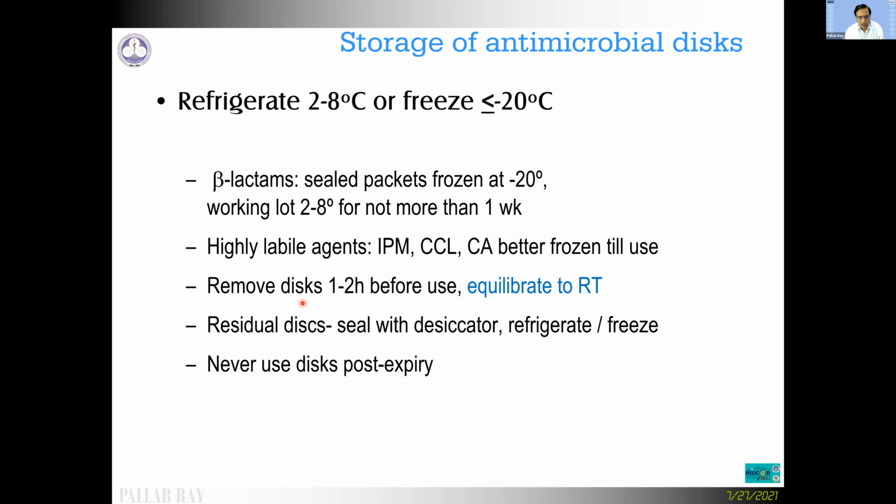It's a very, very important point that you must always remove the discs at least 1 to 2 hours before use and equilibrate the discs to room temperature before you open the vial. Because when you open the vial, if the discs are at a temperature below the environmental temperature, the cold discs will attract moisture from the environment. That moisture will deposit on them.